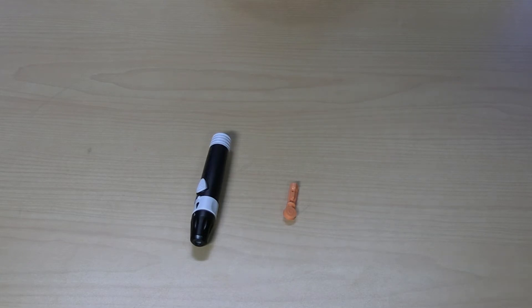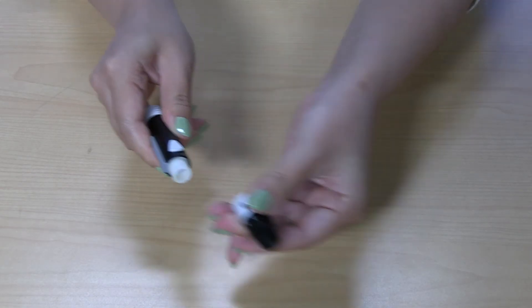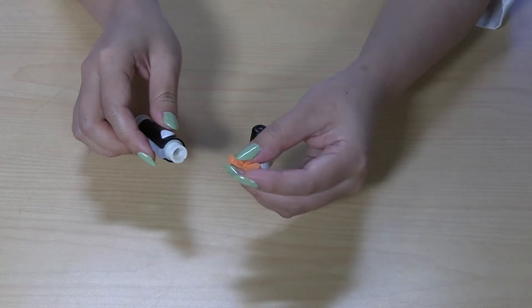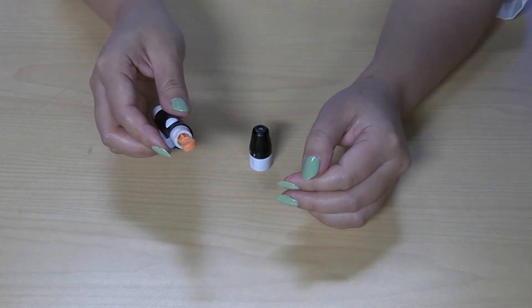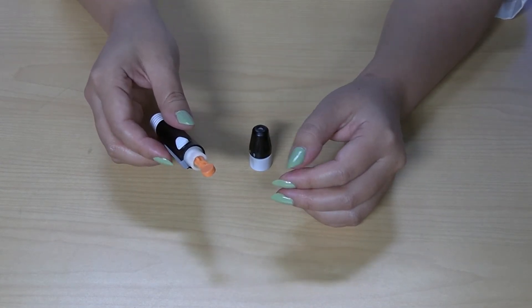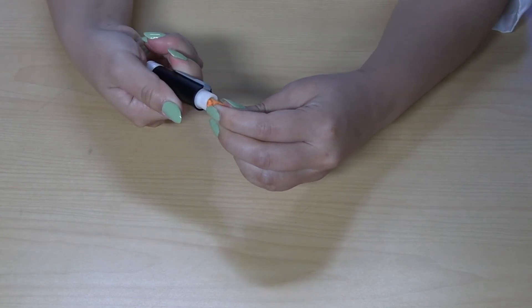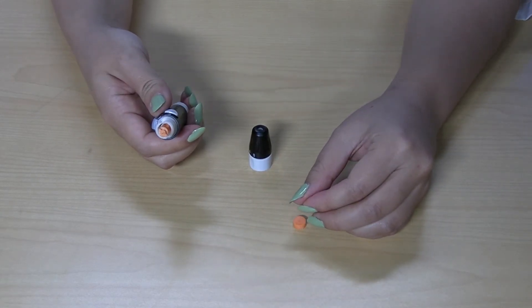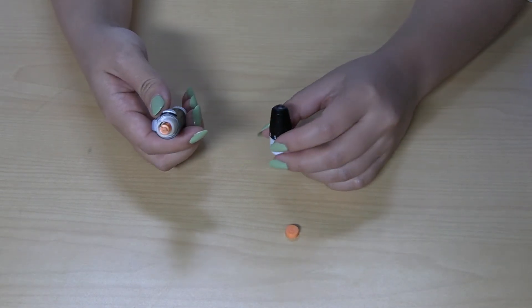Now let's set up the lancet device. Remove the lancing device end cap by twisting it to the right and unlocking it. This is where you will insert the lancet. Push the lancet in as far as it will go. Next, twist the circular cap off the lancet to expose the needle. Save the cap to use it later. Recap the lancing device by twisting the white part to the left until you hear a click.